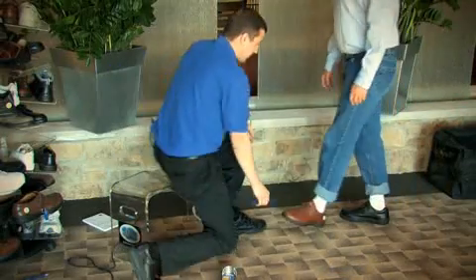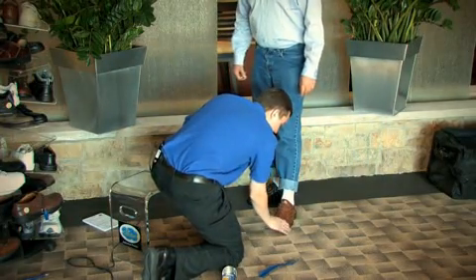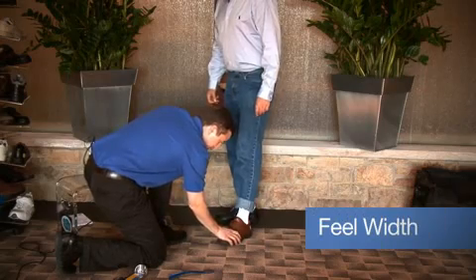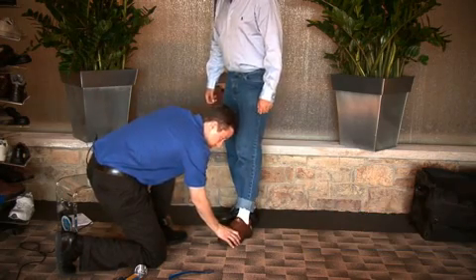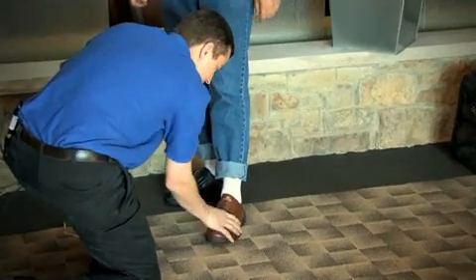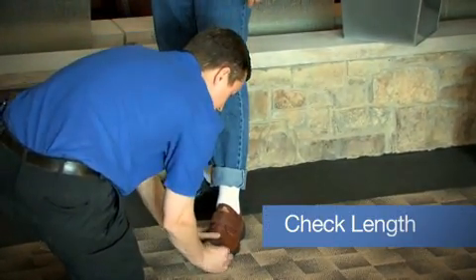Once he's walked around comfortably for a few minutes, of course, you ask him how he feels, and then once he's weight-bearing, we'll feel the width to see if the ball joint is matched up at the break point of the shoe, which is just right across through there, where the first and fifth MTPJ match up. And then you also check the length.